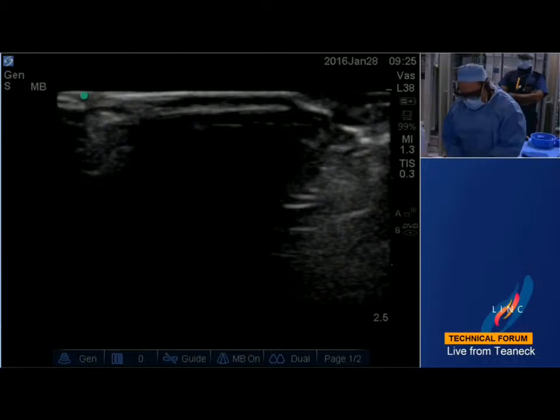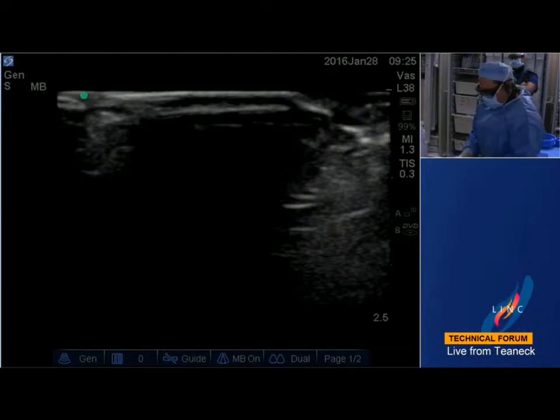I would put him on heparin, of course. If you think of the 3 minute balloon inflation we did in a low flow system, this is kind of dangerous for thrombosis. Yeah. We generally don't have that problem.